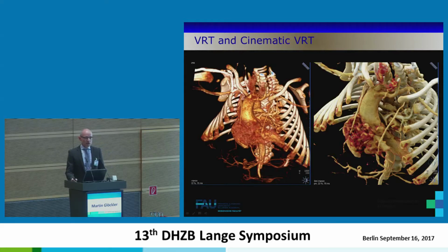On the right side in this slide, you can see a new form of volume rendering technique, the cinematic rendering, which was introduced several months ago. It has the same lighting settings, but with a better natural depth in this data set. The information is more photorealistic and with a better shape perception.